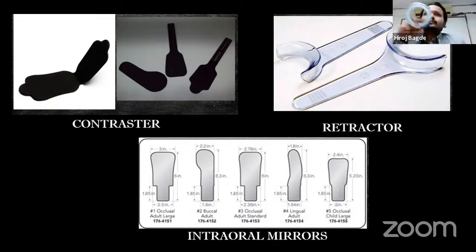That way you become a good professional by yourself, not only because of recording. Whenever I'm talking about retractors, the market has ample retractors. They have a U-shaped bridge, but for me, they should be independent. The clinician should be able to put it inside the oral cavity, and the patient is asked to retract by himself, so that your own hands are free whenever you are recording. Now, a few cases are there. I'll show one photograph.